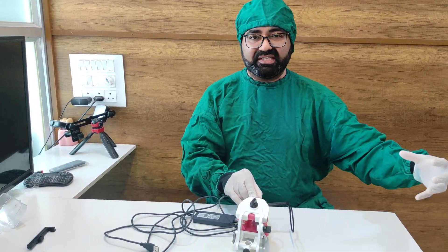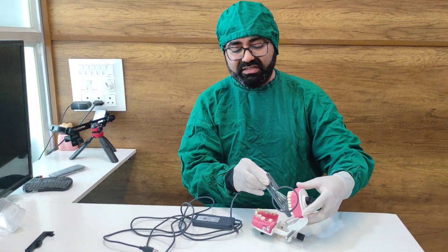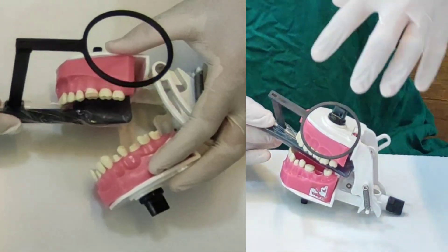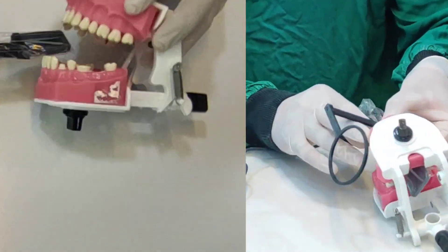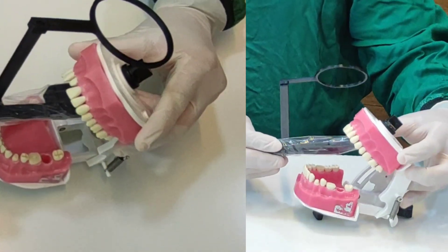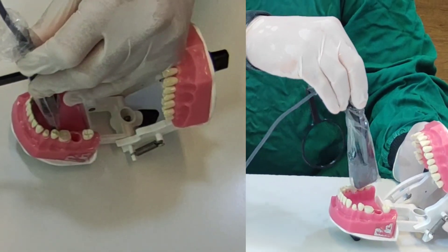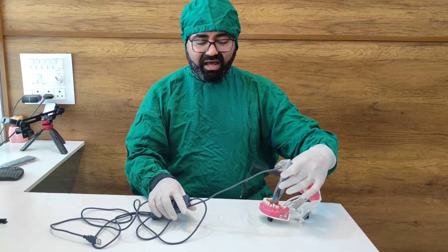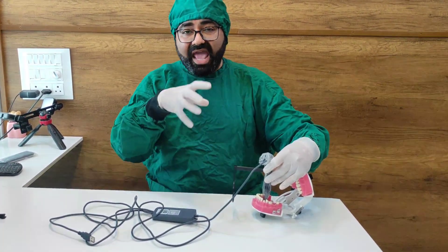So this is how I am going to place it, and now your X-ray head is going to come over here. For example, I am taking an X-ray of the maxillary side — I place it like this and the ring comes over here. This always helps you with orientation — it never changes your orientation and the X-ray comes out perfect. In this position, my X-ray head is going to be positioned accordingly. For anteriors, you do not need to choose a side — you can connect either one and place it at your preference, and the ring will guide you where your X-ray head should go. For mandibular premolars where there is a curvature, it is always difficult to take an X-ray — every clinician will agree to this. You put it a little bit farther in the area and then click an X-ray — it will work wonders for you. This positioner gives you guidance on where your X-ray head angulation has to be.